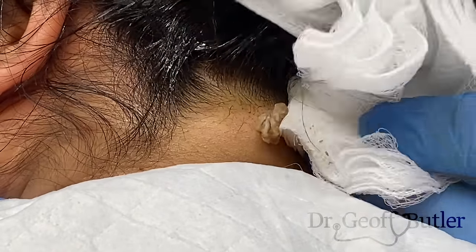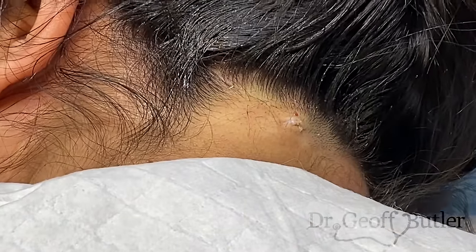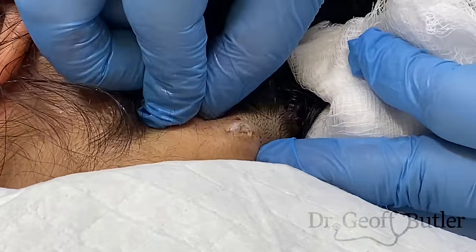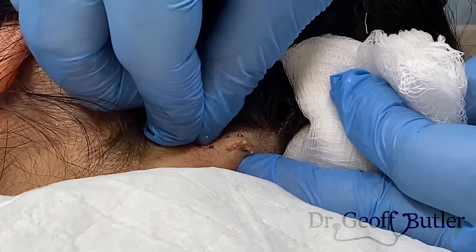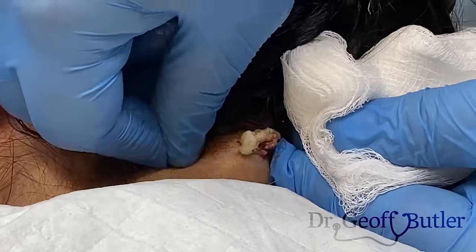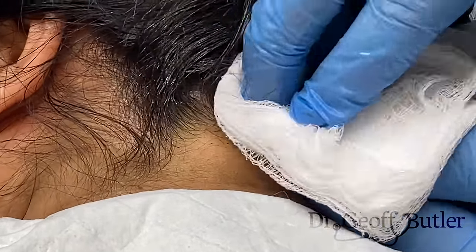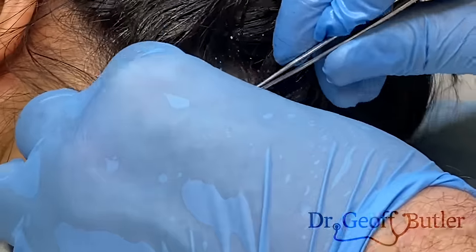She is being a trooper because that's uncomfortable. It's hard to avoid that type of pain because we're obviously exerting pressure across a big area. So even if you have a big circumferential block here, that can be difficult to eliminate, I should say. I'm getting there, just give us a sec. So this is definitely membrane.